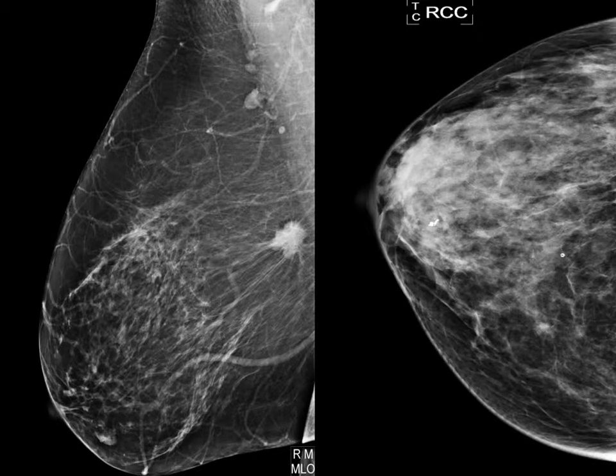Mammography has been a big step forward, but it is not perfect. On occasion, a breast cancer can be missed on mammogram. When this happens, the cancer is usually not detected until it can be felt, and, again, our goal is to find breast cancers before this happens. So to improve screening, we must overcome the limitations of mammography. Before we explore methods for doing this, let's see why breast cancers are sometimes missed on mammogram.